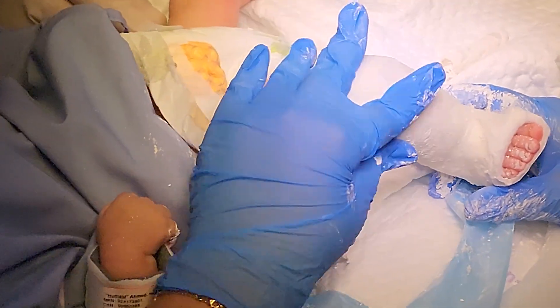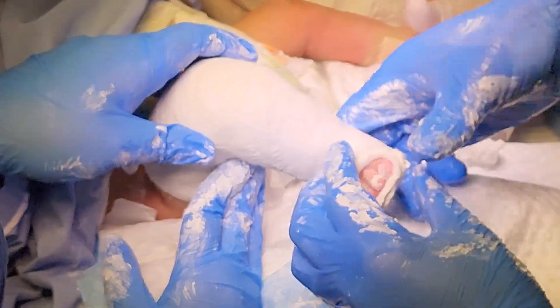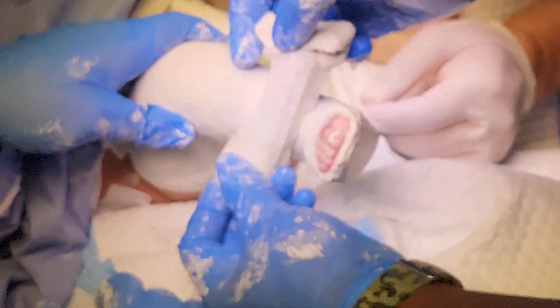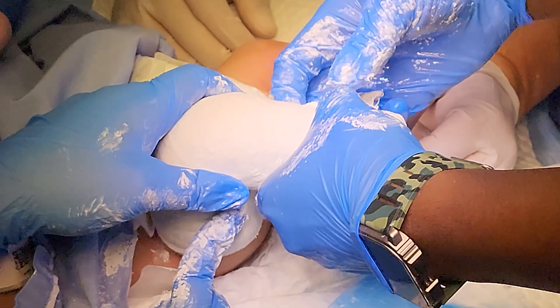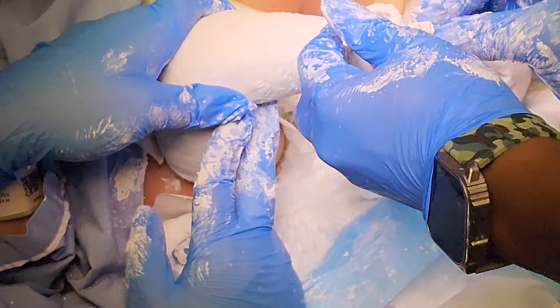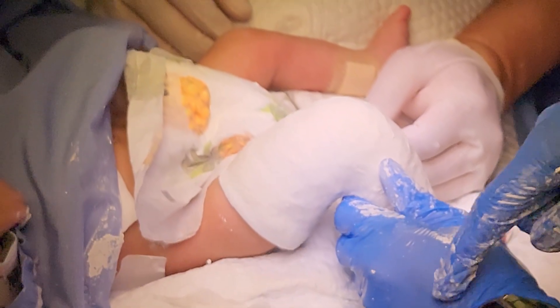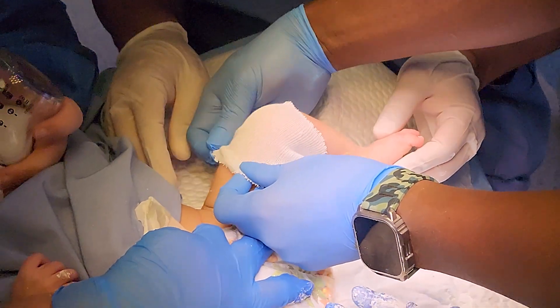Now we complete this side and move to the other side. My colleague removes the dressing and applies a Meplex dressing on the other side. As mentioned, this is the final set of casts for this child and usually stays for three weeks. After three weeks the cast is removed and boot and bar applied. The commonest regime is full time — meaning 23 hours a day — for the first three months, with parents removing the boot and bar for one hour a day, which can be divided into 30-minute or 15-minute intervals. This continues for four to five years and is probably the most common regime across the world, though there are a few other different regimes. Once this side is complete, the other side is done in exactly the same fashion with stockinette applied to the thigh, then soft roll and casting.